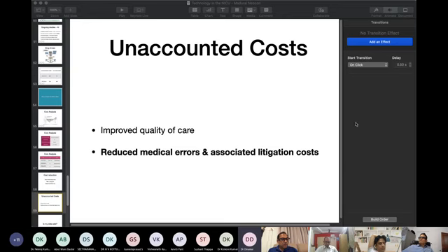During the inflation itself it will measure. In the oscillatory method, BP is obtained not during inflation but when the air is going out. Suntech is using another method, which is more accurate for a neonate. So if anybody is buying a new monitor, please ask whether you are getting Suntech NIBP. It is more accurate. Regarding the TCO2, I think she is going to tell us, and Ram and Suresh might have done a great job on this.